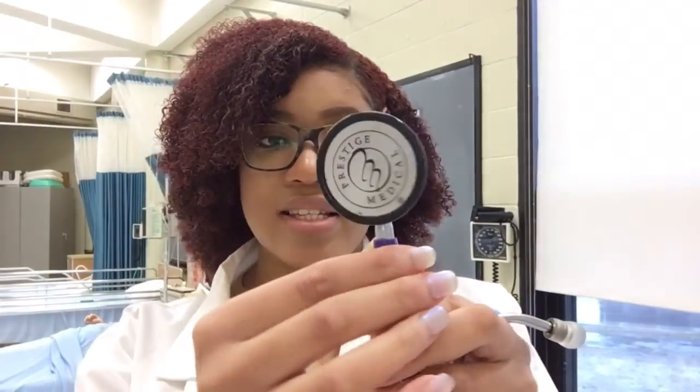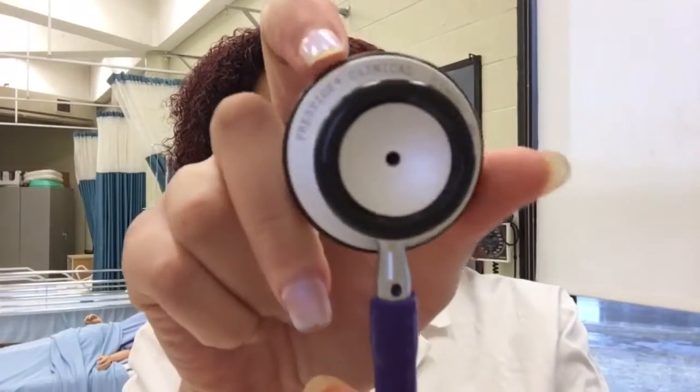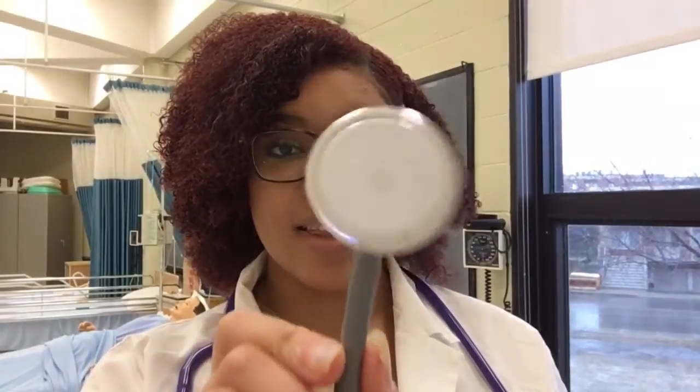Now let's get into how to use your stethoscope. You're going to look at it and see that it has two sides: one side that kind of comes out, and another side that's completely flat. The side that's completely flat is the side that we're going to be using. My stethoscope can turn — if you flip it, you'll see that it's open, and if you flip it again, you'll see that it is closed. Now some stethoscopes are different, like the one I have here, which only has the flat side, so you won't get confused. But if you have one like mine, make sure that it is on the right side.